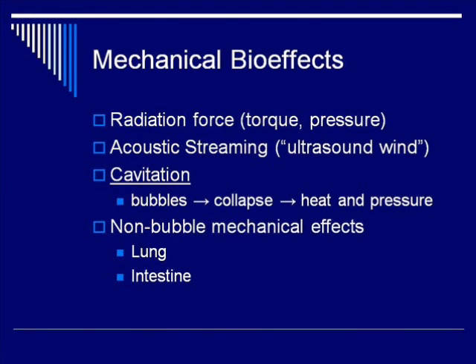Non-bubble mechanical effects are a little more complicated. In areas where the body already has gas, the lung and the intestine, for some reason extended ultrasound exposure can cause red blood cells to just suddenly show up on the wrong side of the capillary membrane. Even using histology, you can't find holes in the capillaries, just red blood cells on the wrong side.